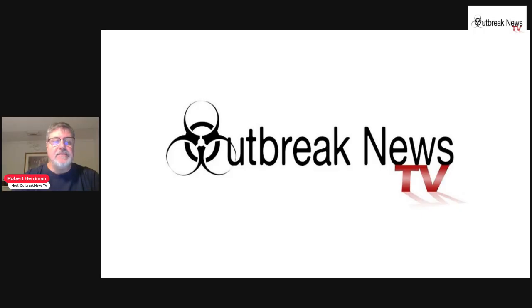I had some comments on the last one and a desire for some more. Hopefully this will help you if you're a medical laboratory scientist or some other kind of student that has to study diagnostic parasitology. I hope this helps a little bit. So I have 20 of them on this video.